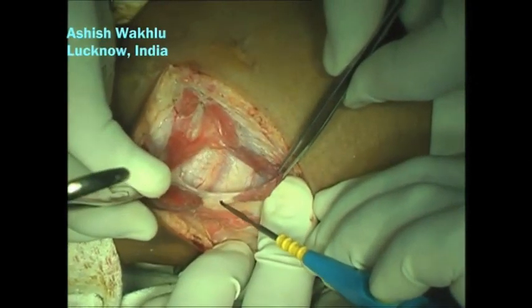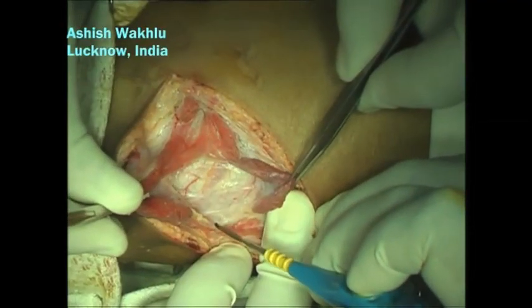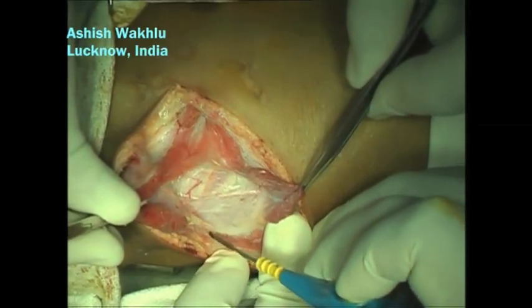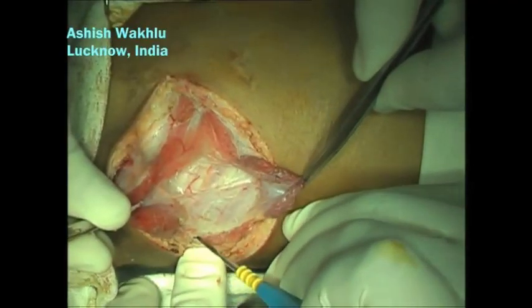The last part of the serratus muscle is being divided, and the final few fibers of the latissimus dorsi, and underneath we can see the ribs and the intercostal muscles.